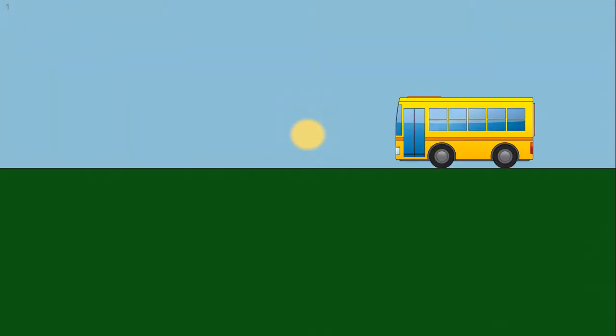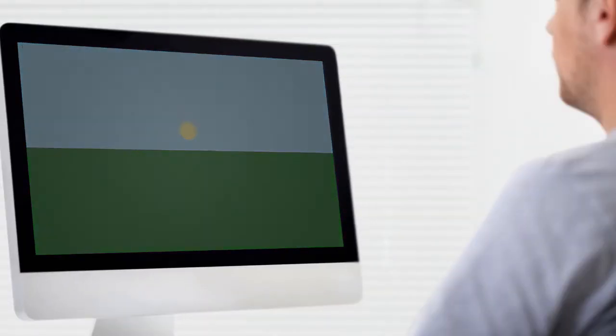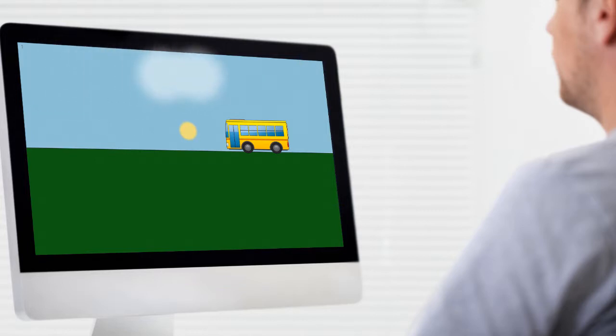The task in this module is to perceive visual stimuli and to react on them as quickly as possible. The patient should sit in front of a large monitor, a minimum of 19 inches, and focus on the fixation point in the middle of the screen. An acoustic signal will sound and an object will appear on the screen. The patient will now scan the screen with his eyes as fast as possible and look for the presented object.